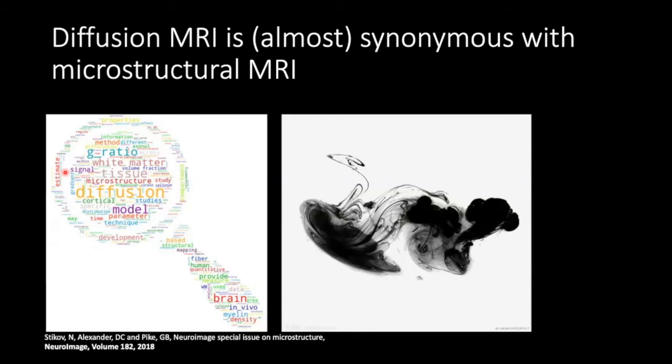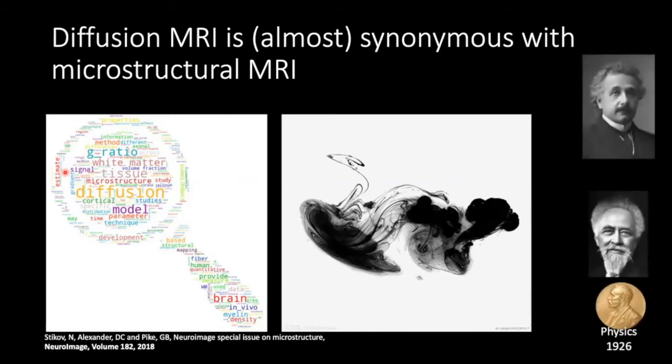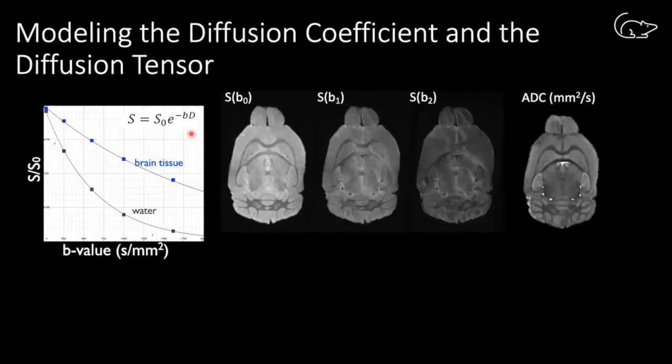And that is that there's a very elegant relationship between water diffusion and brain tissue. It's the self-diffusion, with this long history of Perrin, who got the Nobel Prize for it, and Einstein, who came up with some of the math to describe water self-diffusion or other particle self-diffusion. And we can really leverage this to probe what's happening on the microscale to the cells in our brain. And Stejskal and Tanner were able to sensitize the MRI scanner to this, right? Using the b-value as a diffusion weighting metric, and then measuring the signal at different b-values. You're all probably very familiar with this.